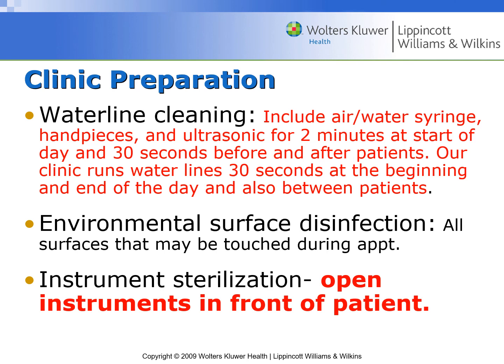Clinic preparation, waterline cleaning: the air-water syringe, your hand pieces, and the ultrasonic all need to be drained for 2 minutes at the start of each day, and 30 seconds before and after patients. And once again, this is exactly what I was talking about before with the water line. It's including hand pieces and the ultrasonic, which have the same issues as far as running those lines.